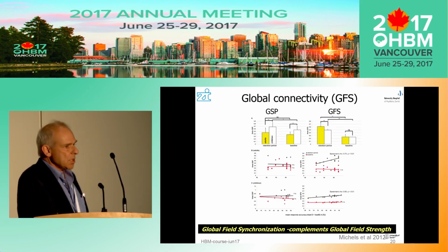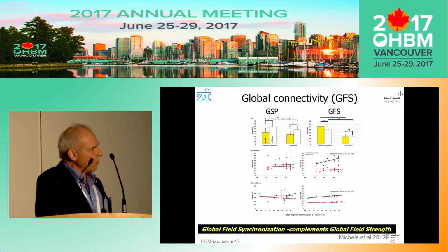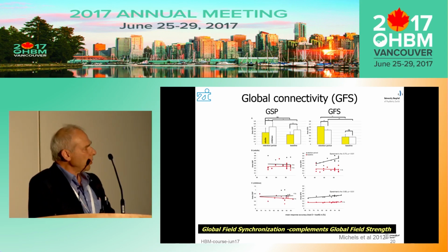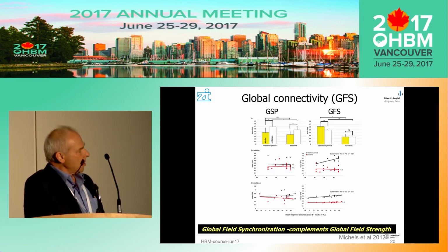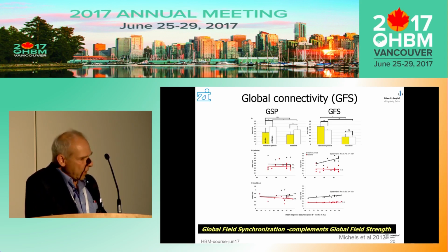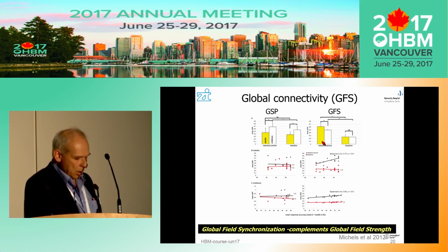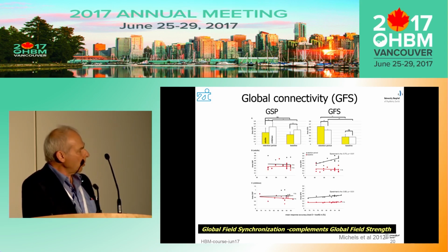And what they tell you is that this kind of measure of synchronization, of connectivity between different regions without lag, is really a bit complementary to measuring the BOLD correlates of power fluctuations. That's in a working memory paradigm, in a developmental study, and essentially we found very prominent effects of development, comparing children with adults. And you can see that these patterns are quite distinct, the power correlates of BOLD and field synchronization correlates.